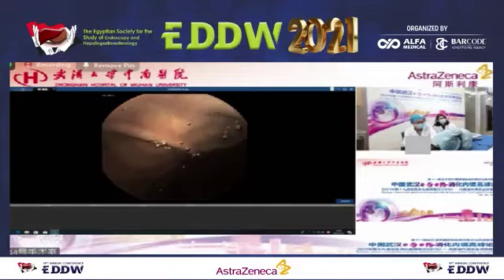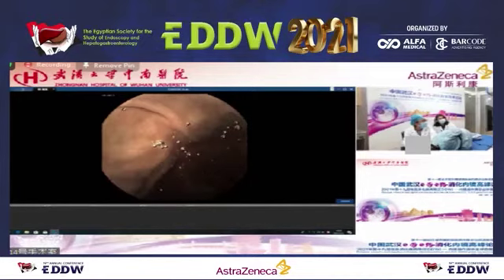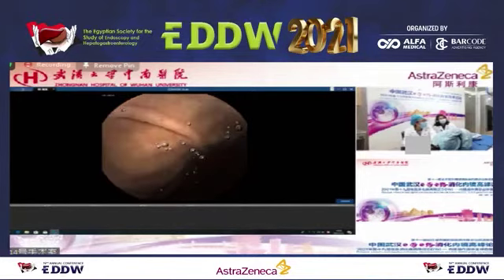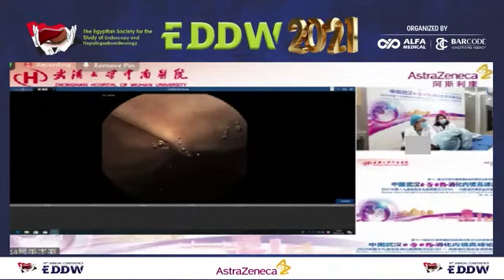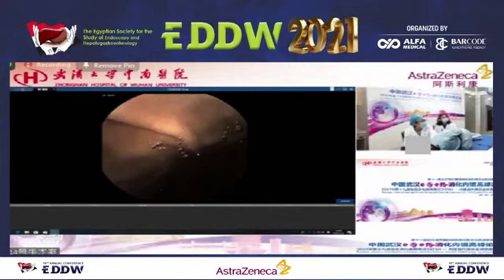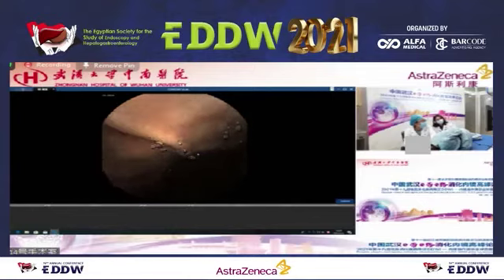We did the preparation almost 2 hours ago, so there's a little bubble. Usually, taking the defoamer 40 minutes before swallowing the capsule is a suitable time.